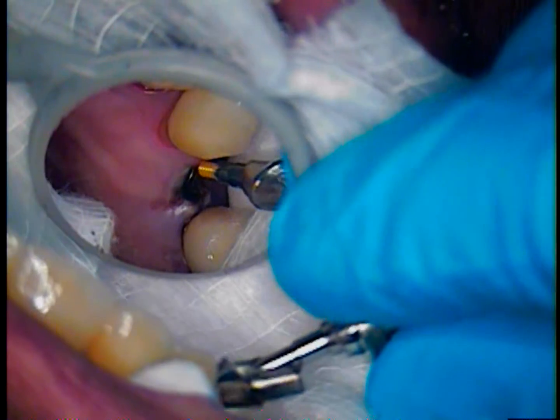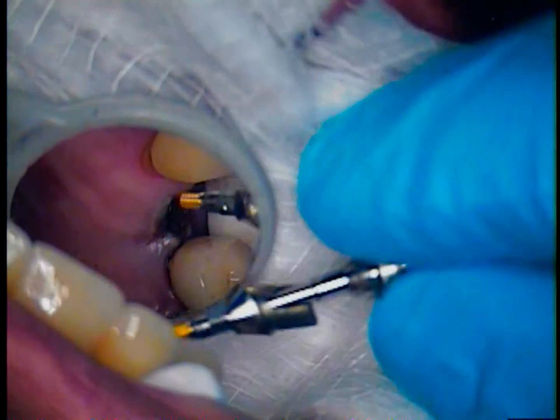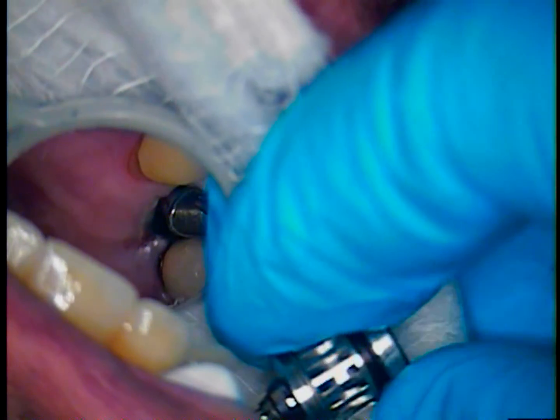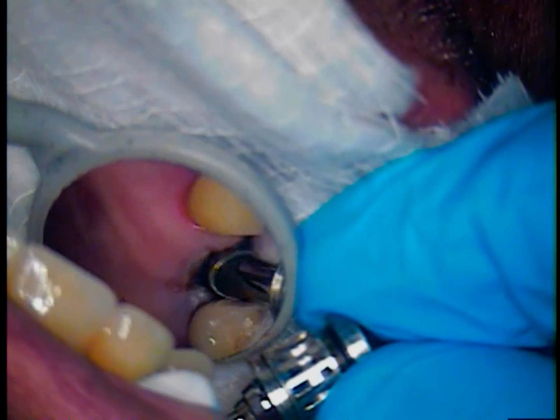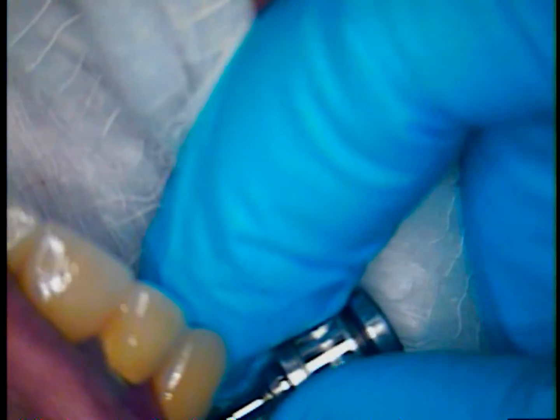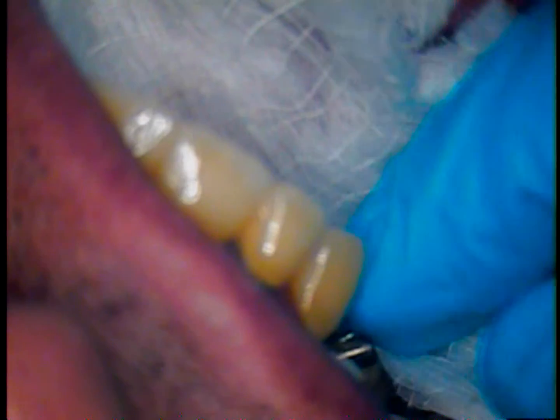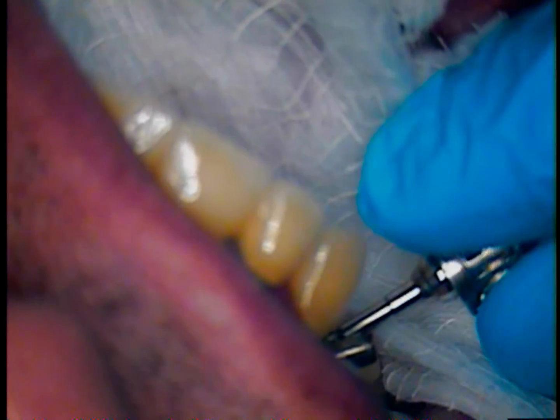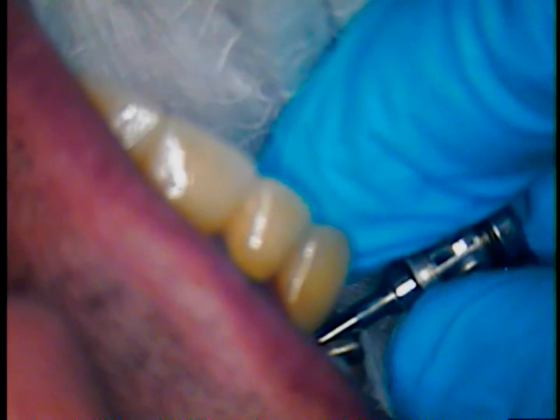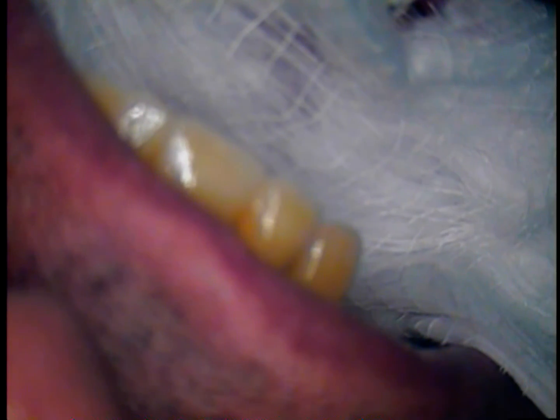So here we are, ready to try it in. The mesial aspect — that part of the abutment — is facing the canine tooth. Now I'm inserting it and lining it up, just getting a feel for the threads ever so gently. I don't want to force anything at this point. So I'm going to use a blunt-end gold instrument — it has absolutely no cutting edge on it whatsoever; it's just a plastic instrument used for placing composite. Now I've pushed it in place, I'm looking at it and checking the path, and I'm finding that the path is a little different.